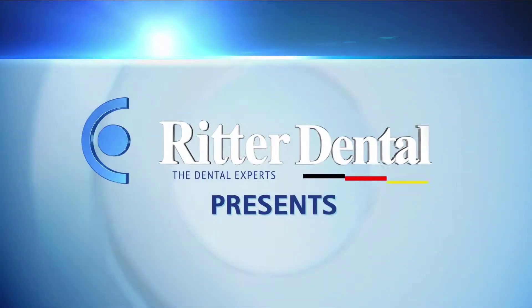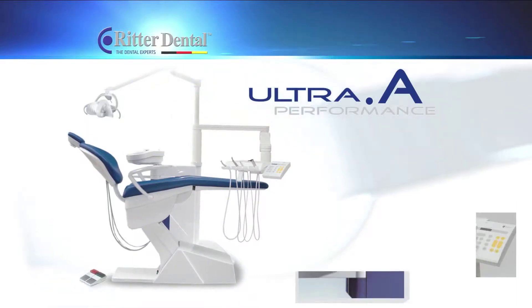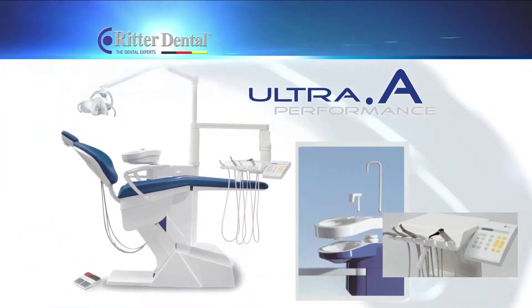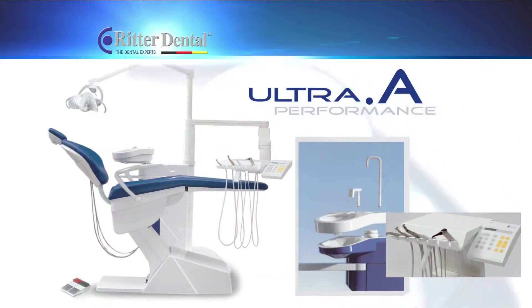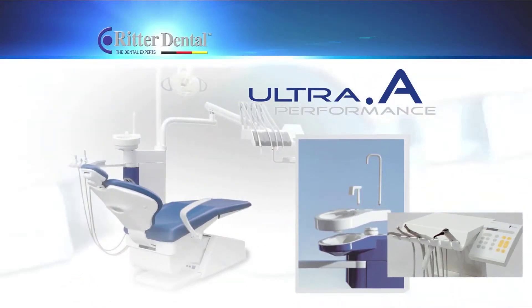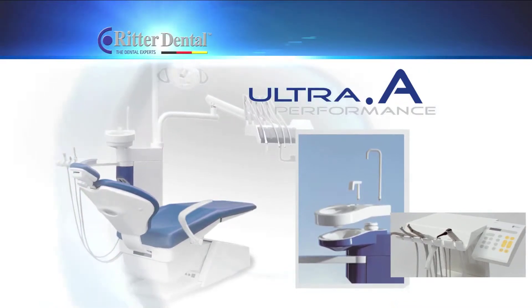Ritter Dental USA presents the German-engineered and German-made Ritter Ultra Performance A Dental Unit. The Ritter Ultra Performance A Dental Unit remains one of the best-selling dental units on the market due to its advanced technology, modern design, and consistent reliability.